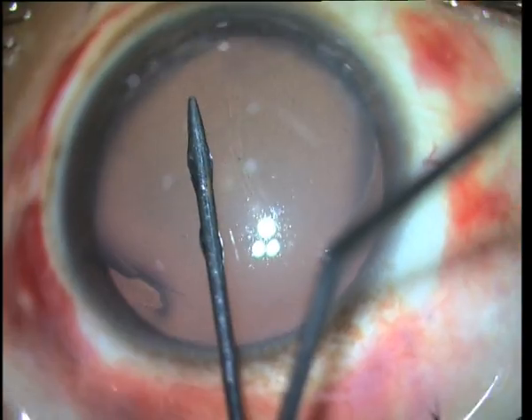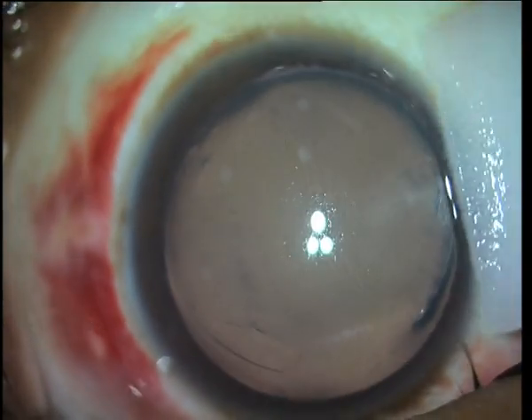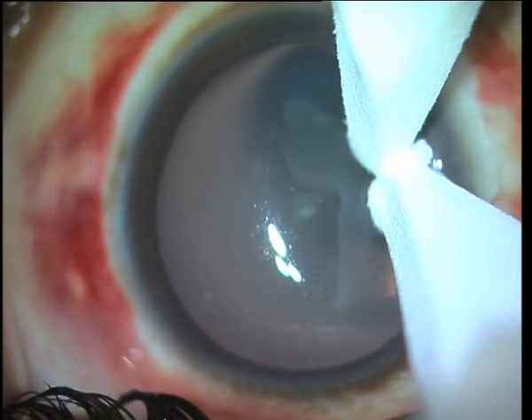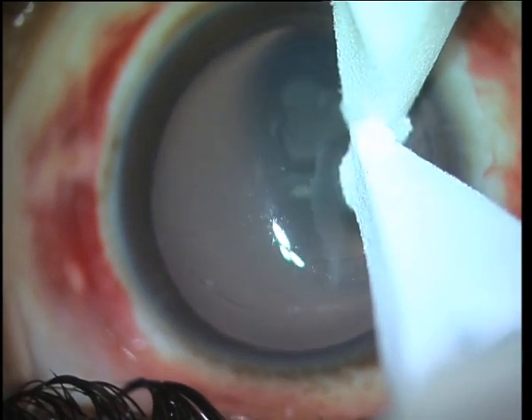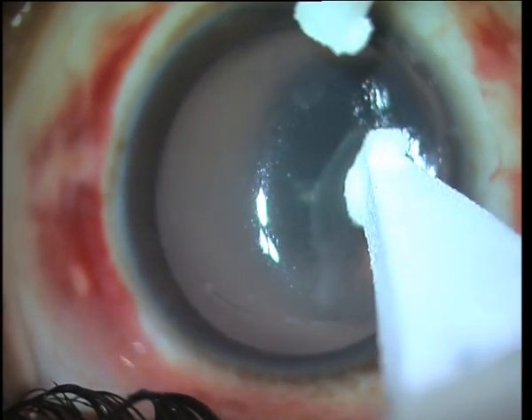It's important to stretch it out as much as possible. Here you can see I've taken two Weck-Cels and I'm actually pulling in the opposite direction in an attempt to stretch out those macrostriae. It is important to treat macrostriae as early as possible, because the more you let them remain, the more they set into place and the more resistant they become to treatment.